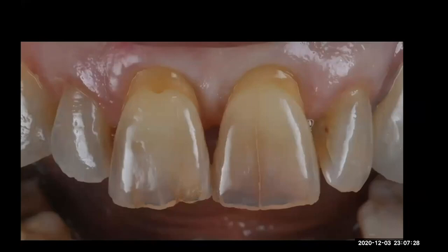Let's take the color. I was super impressed when I saw that kind of contrast between cervical dentin and incisal edge, because if you observe it carefully, you can see properly the real opal effect. The opal effect that you see in the incisal edge is amazing. I was in shock when I saw that, because the person was super tired of those teeth and wanted to change them. So I asked the doctor to put in an intraoral mirror, because I was curious why that opal effect was so strong in that kind of teeth.